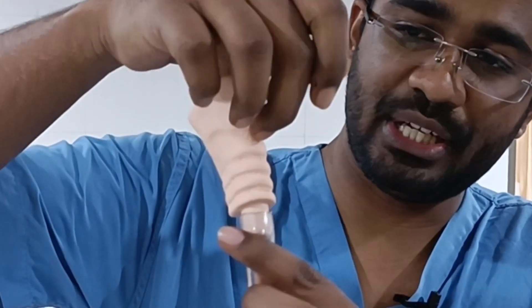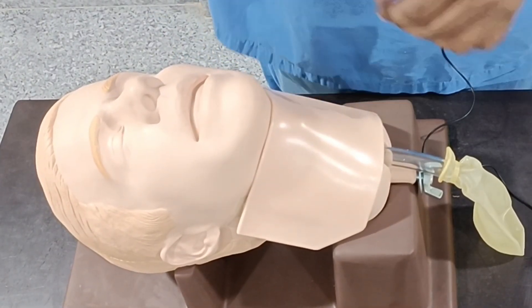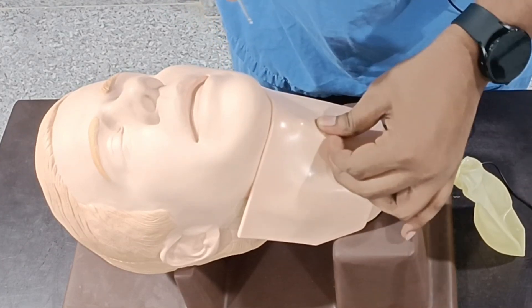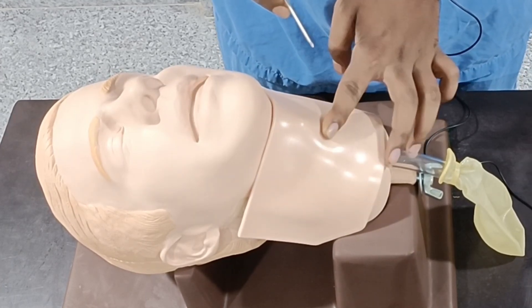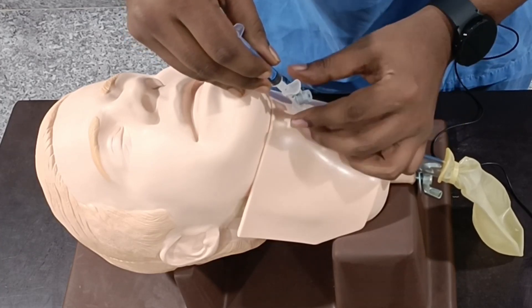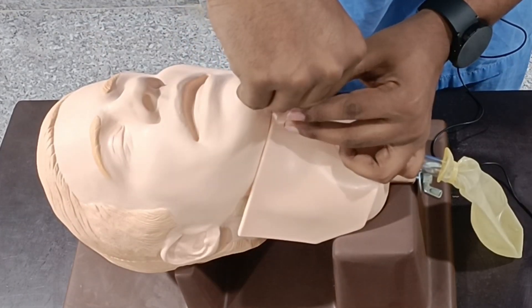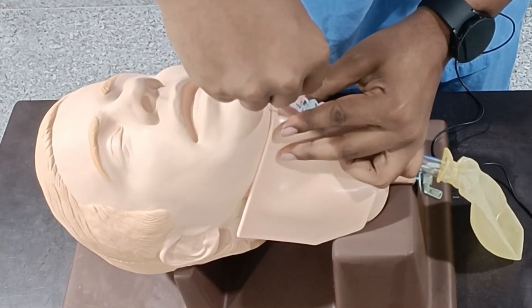We will be inserting our needle into the cricothyroid membrane at an angle of 30 to 45 degrees, directed from the thyroid toward the cricoid cartilage. We pass our fingers to locate the cricothyroid membrane, insert the 16 gauge cannula at that angle, feel a pop as we enter, check for backflow of air, then remove the needle and advance the cannula into the trachea.